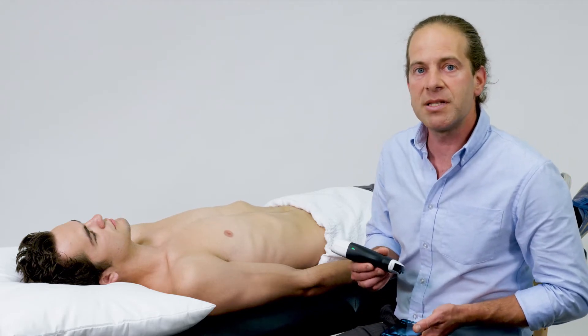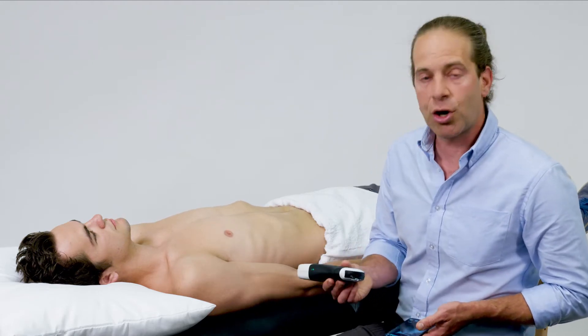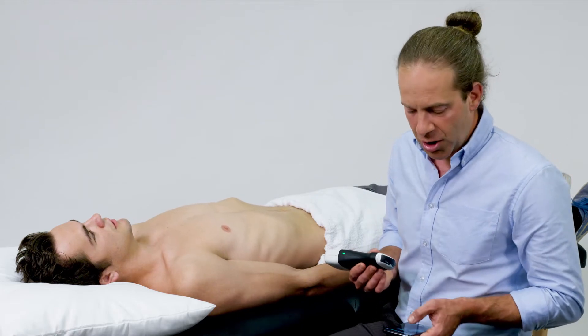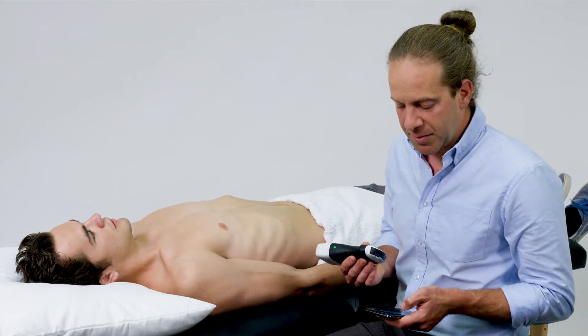To perform this scan, I'll use a curvilinear transducer, making sure I'm on the abdomen preset.